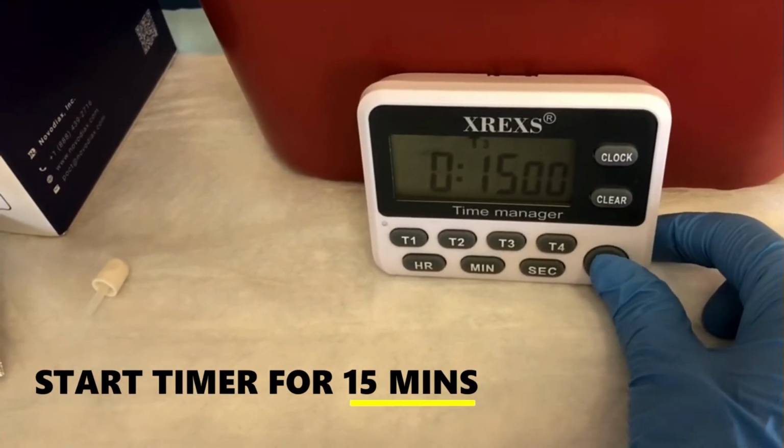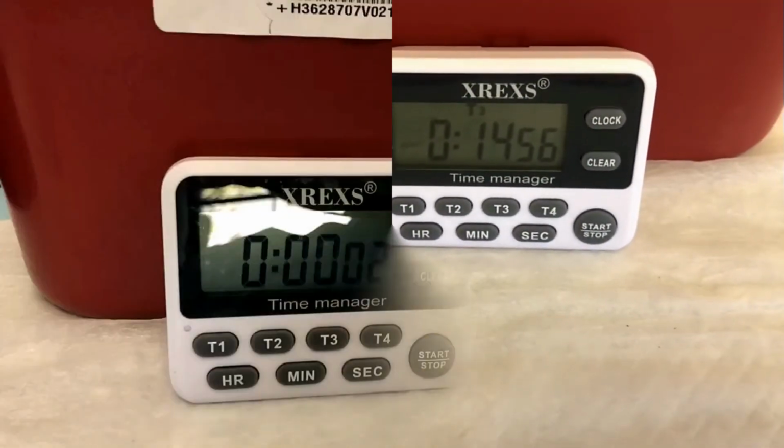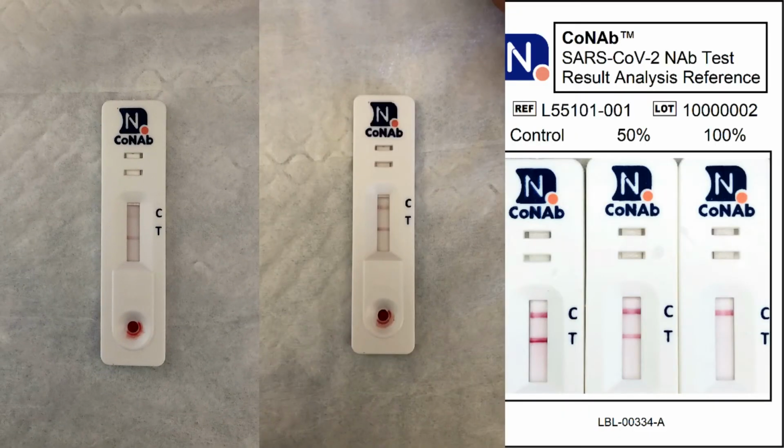As the test strip is incubating, results will begin to appear in the center strip window. For best results, allow the test strip to incubate for the full 15-minute interval. Read and record the test results within 30 minutes of test completion. Avoid reading the results after this time.